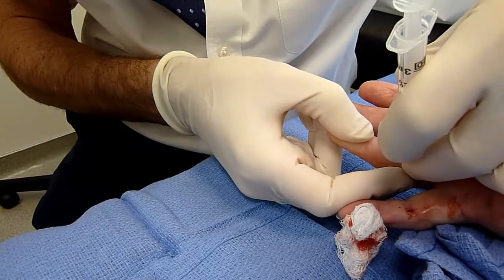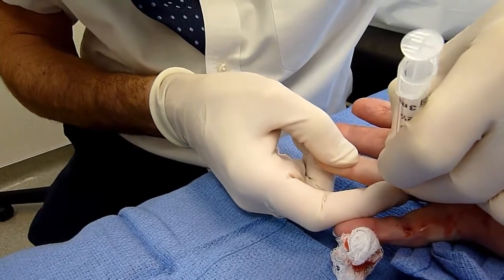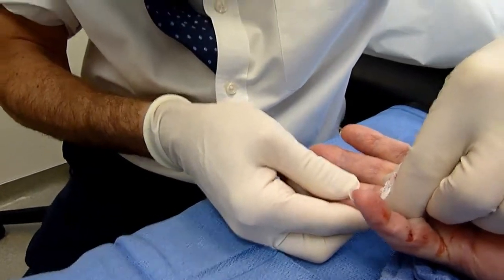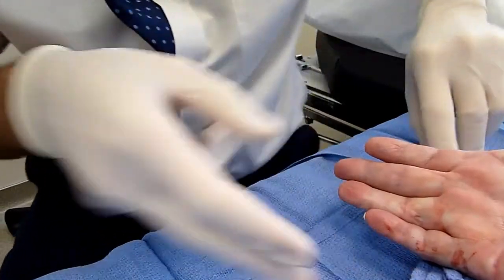It's the touch of Dr. Watchmaker. Kind. There we go. Ooh. So there it is. Ooh. All right. That's a good one. It is. You had a pretty well-defined cord there. Ow! Final bend. All right. So now straighten out as best you can. That's great. You are a star. All right. That's so great.